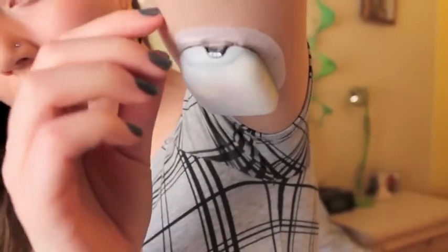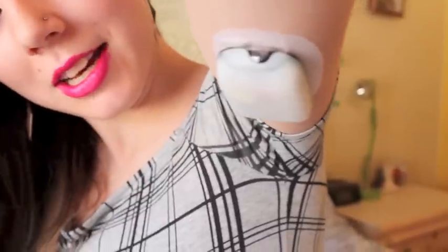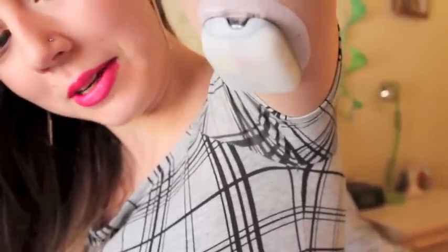What I'm going to have to do is basically peel it off. It's kind of like ripping off a band-aid. It can be kind of painful, but you get used to it and you learn different techniques for how to get it off the fastest. Usually it's best to sort of dampen the adhesive around the pod so that it kind of dissolves it a little bit and makes it easier to pull off. You can use baby oil for this. I couldn't find any before I filmed this, so I'm just going to use lotion, and you can use pretty much any kind of lotion or even just water. So I'm going to do that right now.